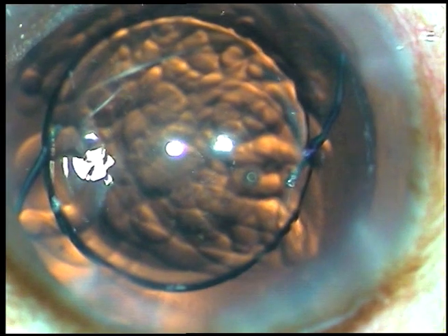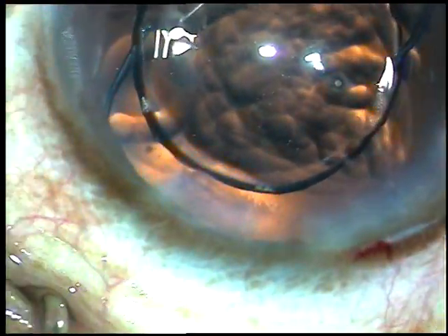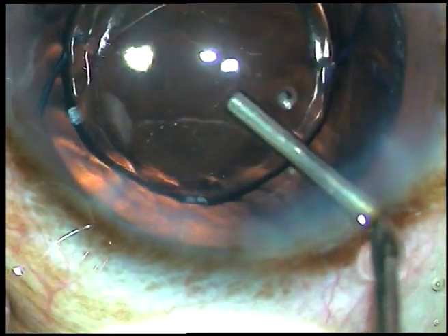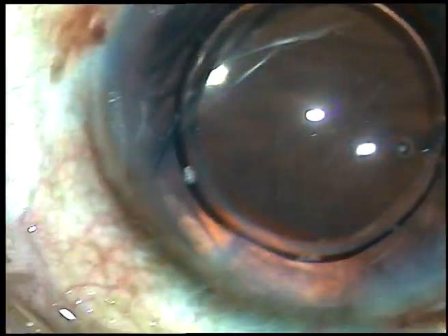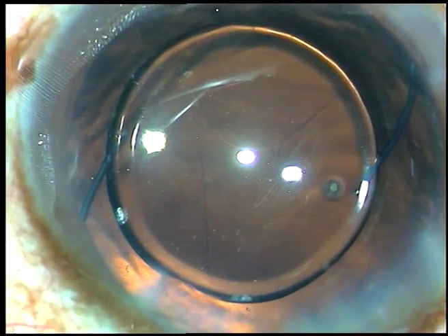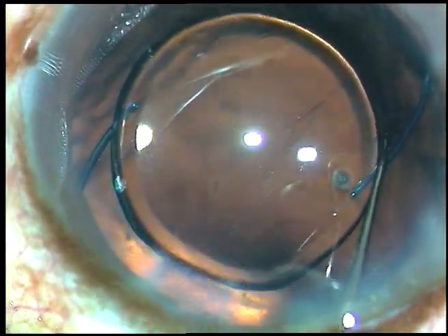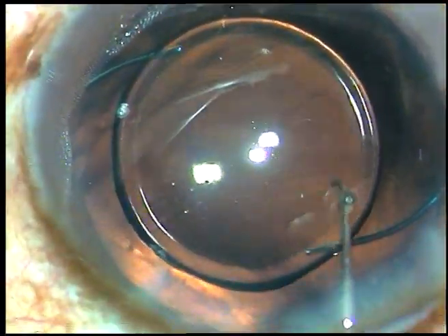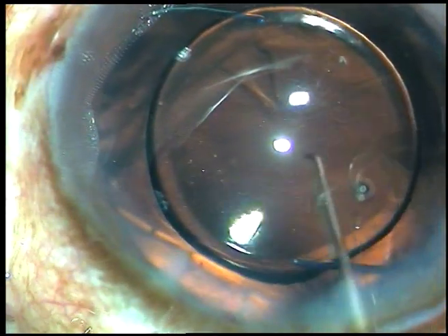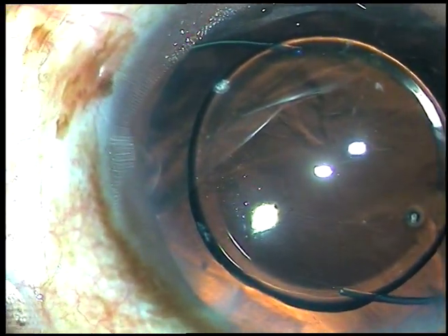Now I am injecting viscoelastic substance to dial the intraocular lens so that the haptic which is at the rent area can be brought superiorly. I take a Sinskey hook and pull this haptic. Now the lens has moved and the haptics are far away from the rent area, and the lens is behind the anterior capsular rim — that is, in the capsular bag.